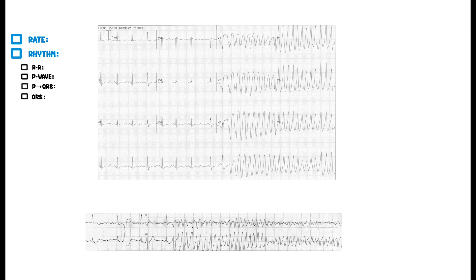First thing: rate. How do we determine the rate? Let's take a look at our rhythm strip in lead two. What's really interesting is you're going decent — one, two, three — so 300, 150, 100, a little under 100. But then boom, you start moving super fast, going about 300 beats per minute between each of these R-waves.